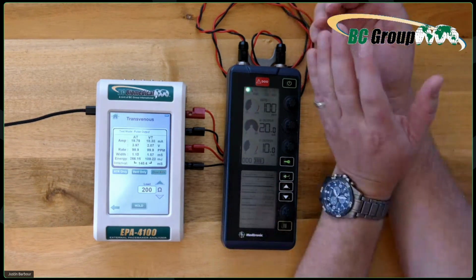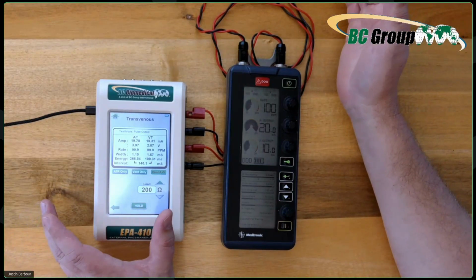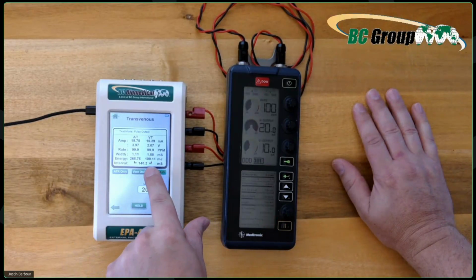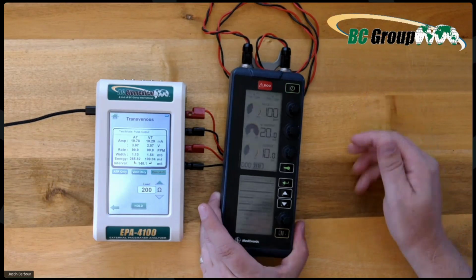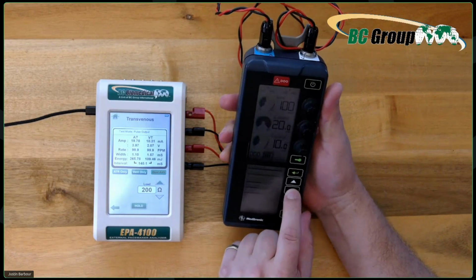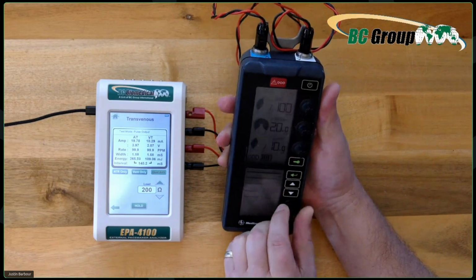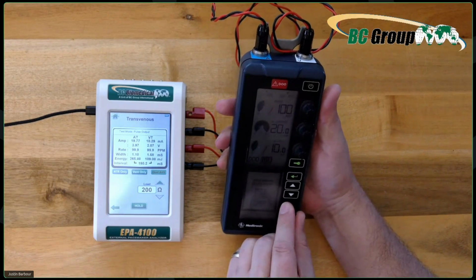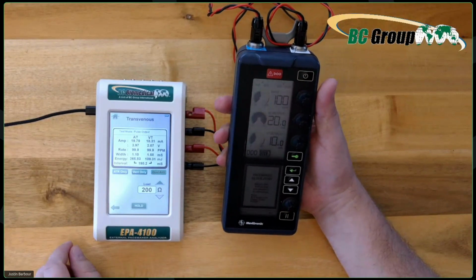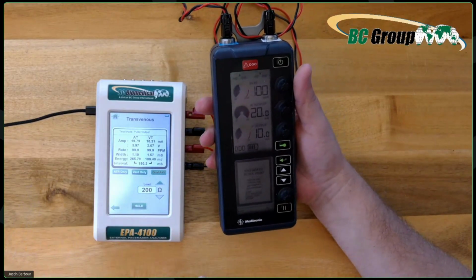Now, mind you, I told you that this is the primary difference between a traditional pace analyzer that you find on your defibrillator and this, because this guy here can do the timing. You see, it says 140 milliseconds. That is found down here in the submenu of your Medtronic. We can access that by coming down here, and we've got AV interval, and we can turn this up. Apparently I turned it up to its max point. The maximum it'll go is 190 milliseconds, and that is the timing between atrial and ventricle discharges.